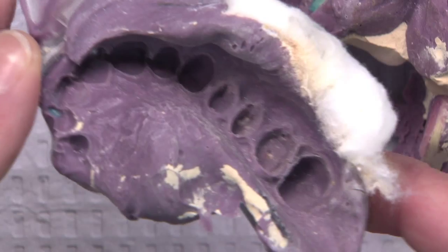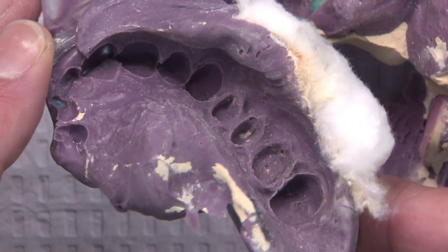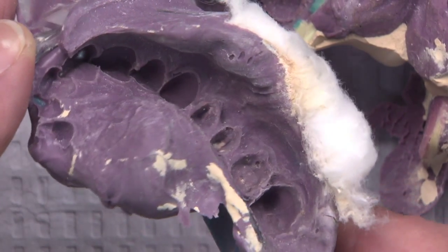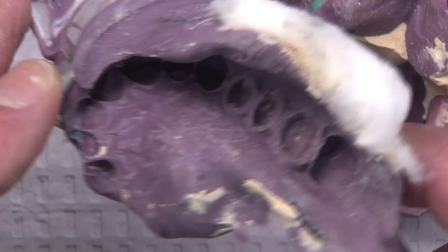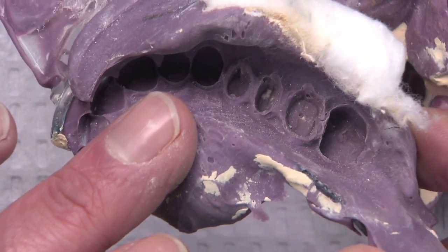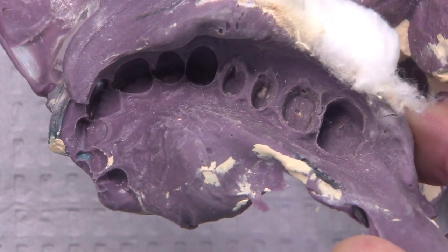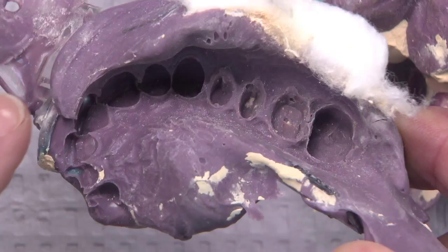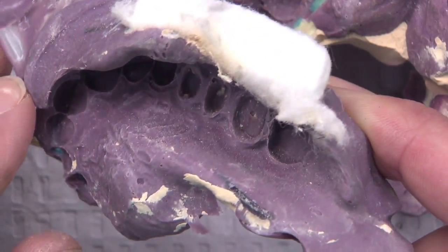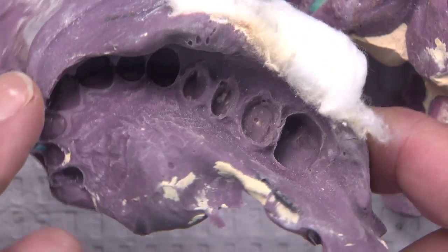If you're going to use something without retraction, that's when you're going to want to use an extra light body. Not that I even believe that works. I really don't think there's any material that's thin enough, and I don't think you can generate enough force with this heavy body stuff to push impression material subgingival, to push the tissue away from the tooth and really be able to get in there. I think you need a clean, dry sulcus. Most of these materials are hydrophobic unless they're polyether, and this might be a polyether.